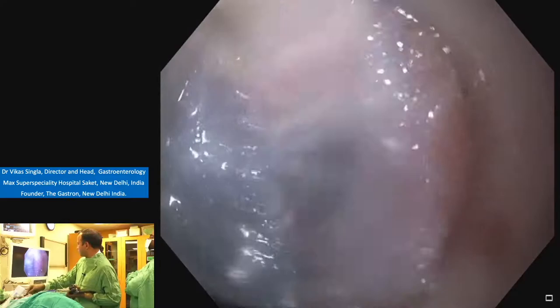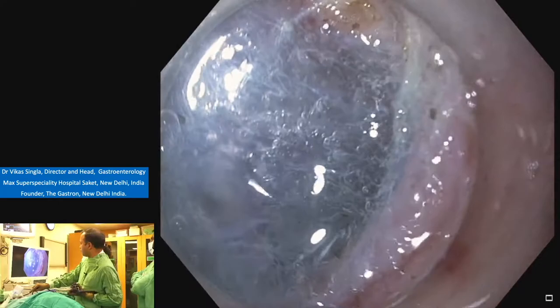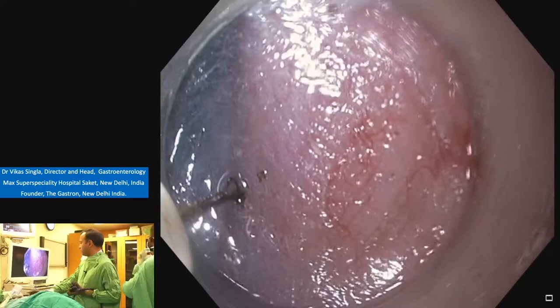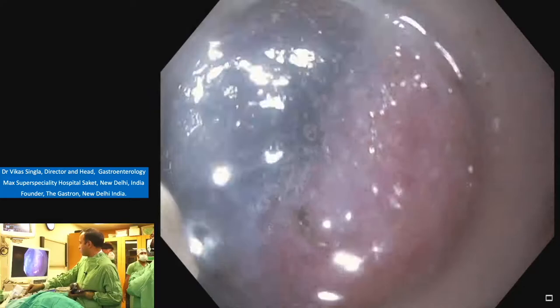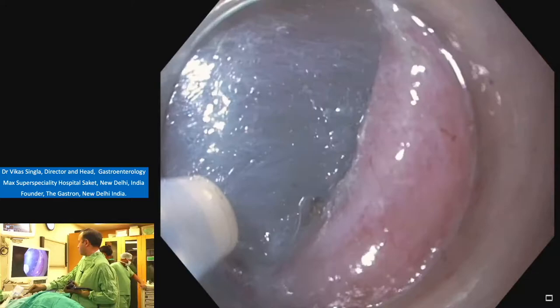And each time you can see that we are stretching the fiber with the help of cap. So whenever we have to stretch the fiber, we have to do two things. One is pushing the scope so that it can stretch the fiber, then we inject. So two things, pushing with the cap and then using the fluid. Then same step again, make a hole in the submucosa, engage the fibers, go to the other side. Inject. First stretch with the cap.